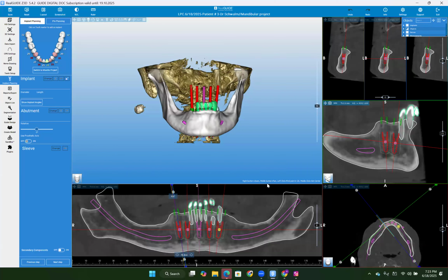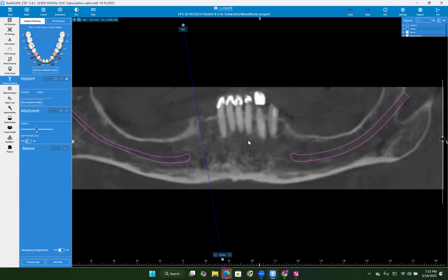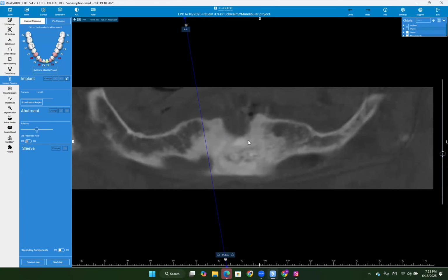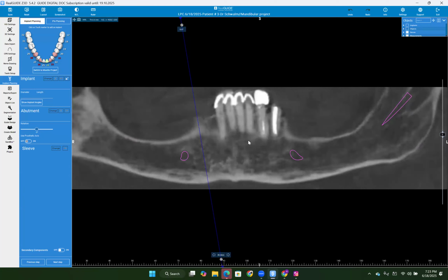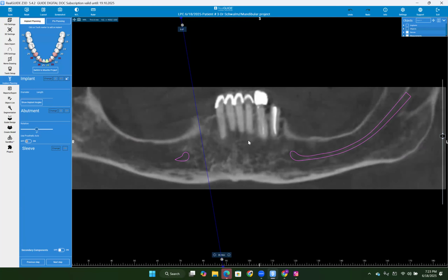So it's an early 60s-year-old lady who has an upper denture. Her lower teeth are really busted up, and she would like a snap-on of some sort. She's been missing those lower posteriors a long time, lost a lot of bone. So she is aware that a lower conventional denture is just going to be terrible for her. I discussed with her both fixed and removable implant retained options.